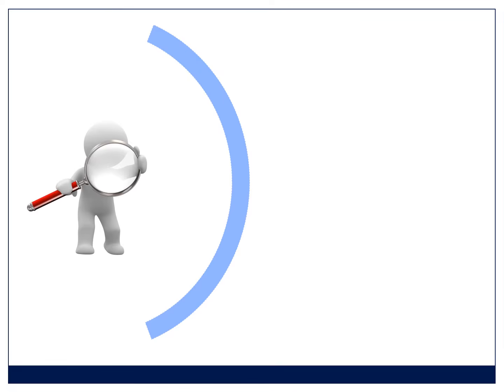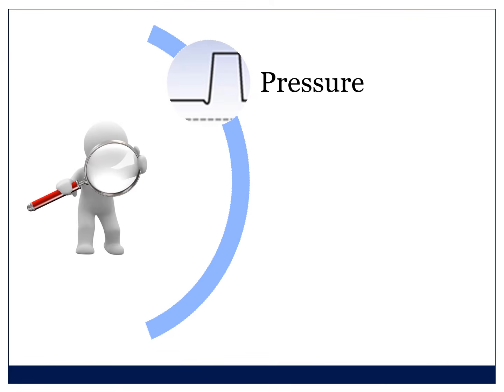Now remember, ventilation is a dynamic process. You can't just set the ventilator and then you're done for the operation. So you have to monitor certain things, and you've got to get used to watching the ventilator and the response to the ventilator. The first thing you want to watch is pressure, especially if you've set a volume. So watch the pressure, see what your peak inspiratory pressures are, see what your plateau pressures are, and have a feeling for what the patient had at the beginning and watch how it changes.